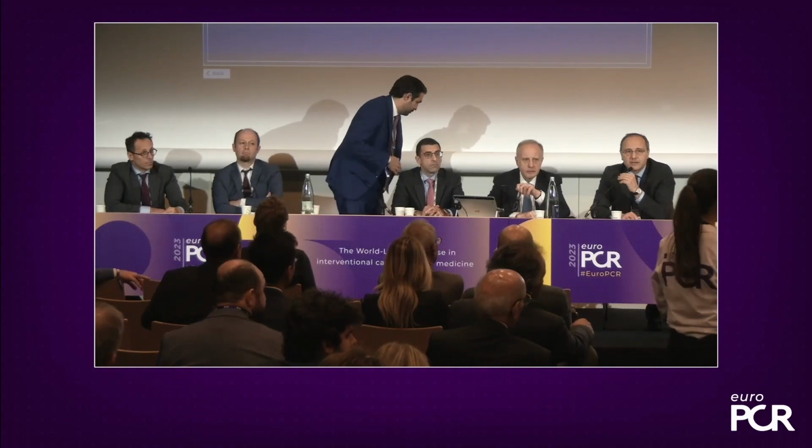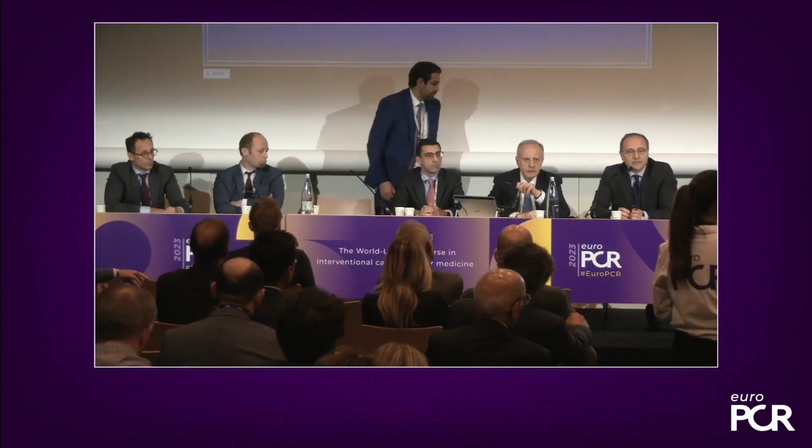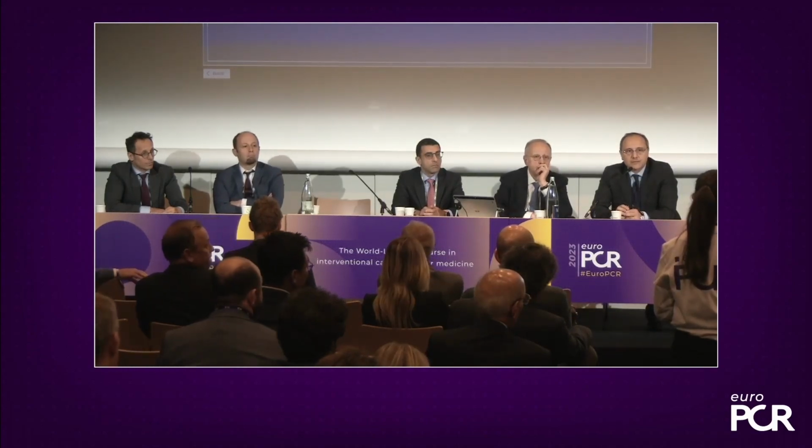Thank you. Just one more comment I would like to make. Of course, intravascular imaging is a perfect tool to assess how well the stent was deployed. But once we've done an FFR-guided procedure, it would be a shame not to use it to assess.